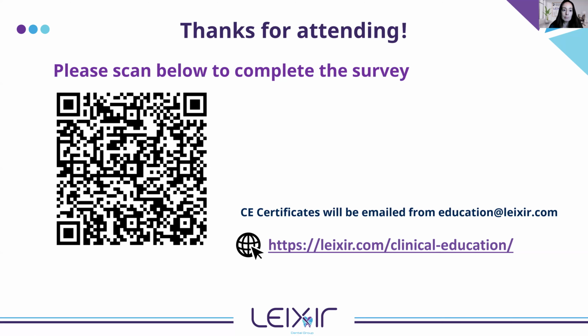Great. And with it being cloud-based, there is no more having to download the latest version. It automatically gets pushed out. We're doing constant updates on our DS Core platform: we have large quarterly updates, but we also do them on the weekends and late nights to make sure we're adding features and making it more intuitive day after day. There are some really neat things coming later this year as we start to scale into more implant dentistry. You guys are like the iPhone. Yeah, it just automatically gets pushed out. So no more downloading versions or making sure licenses are updated. Those days are gone now.